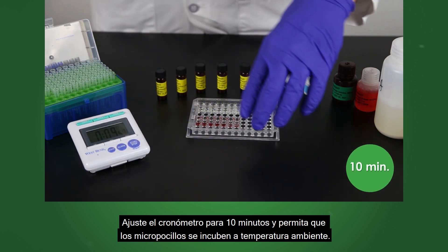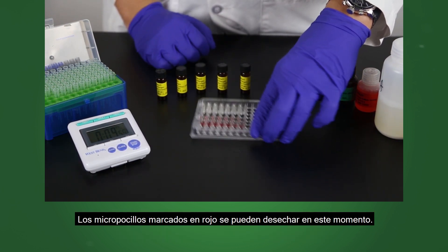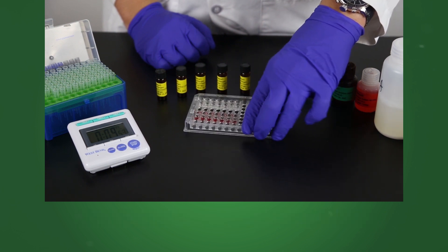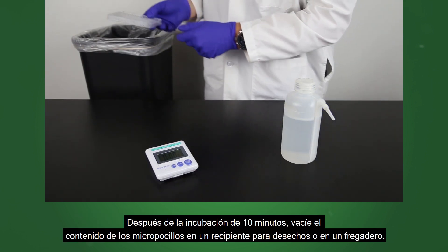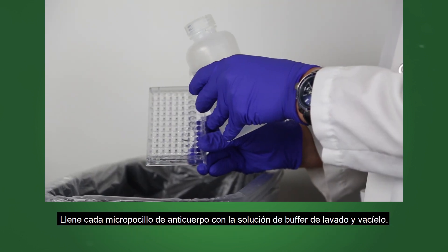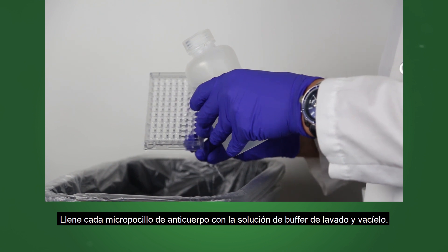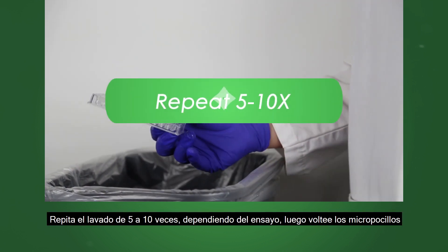Set timer for 10 minutes and allow wells to incubate at room temperature. The red marked wells can be discarded at this time. After the 10 minute incubation, empty the well's contents into a waste receptacle or sink. Fill each antibody well with the wash buffer solution and dump out. Repeat the washing 5 to 10 times, depending on the assay.